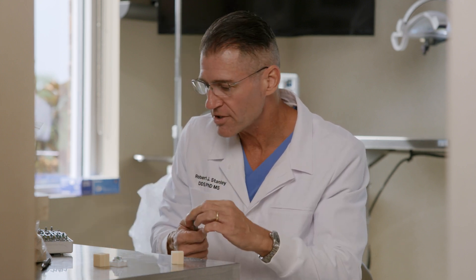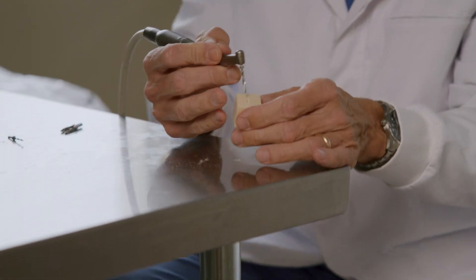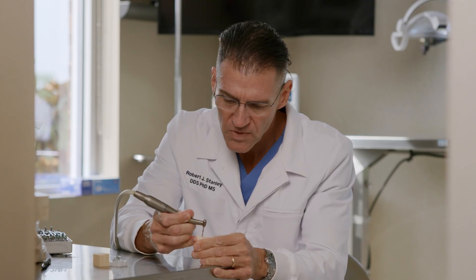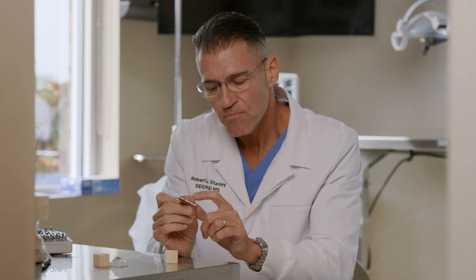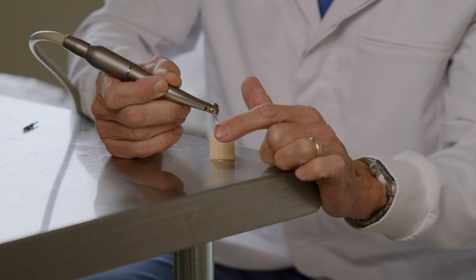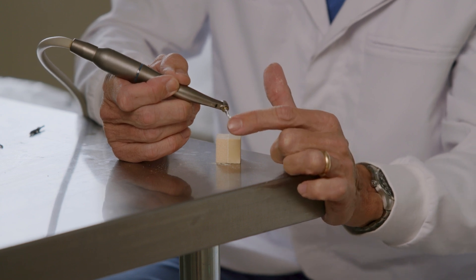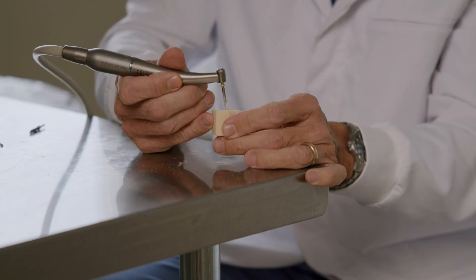Let's see if we can fix this. We'll go to a bigger size drill — now that we know we're getting kicked off to the soft side, we can make it better, right? We're going to force it to the left, into the dense foam. But it's still off. The main reason is these drills are not designed to cut on the side. The cutting flute is designed to remove waste; the tip is what does the work. When you try to bodily move this laterally, it doesn't work.